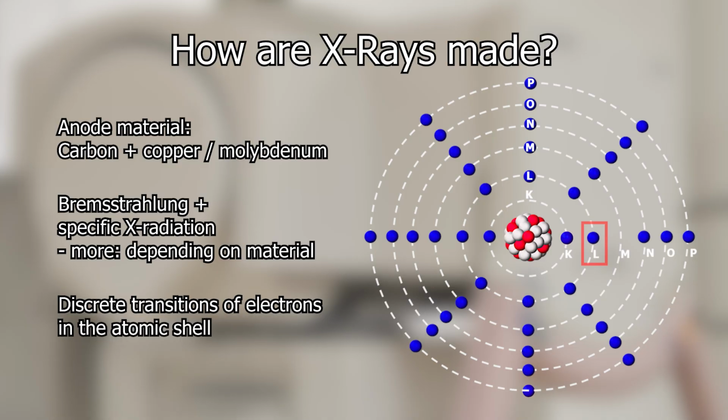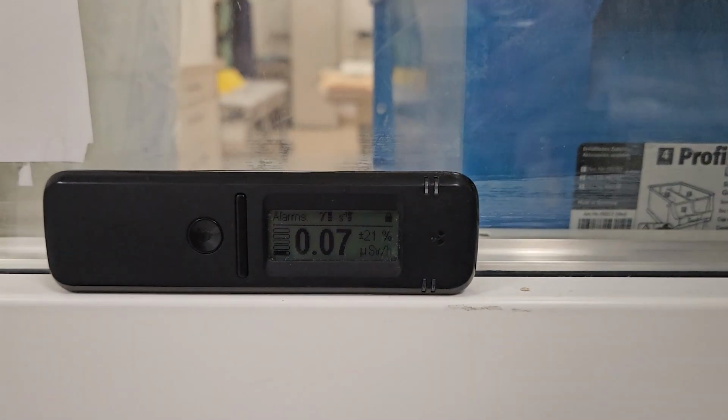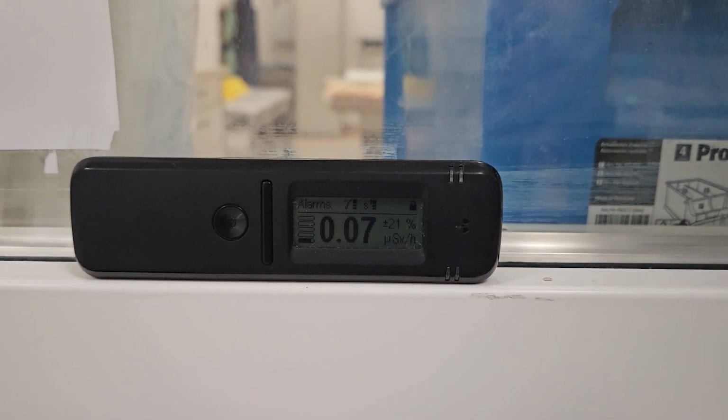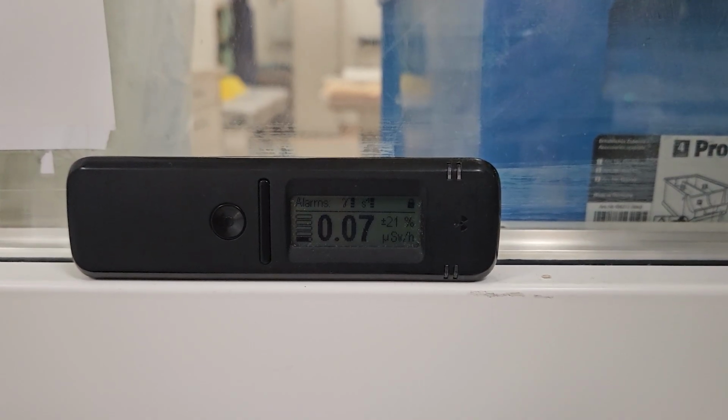We can use this device now with the basics in mind, but at some point we should add another theory part when it comes to the finer points of the operation. Right now we are imaging. However, we can only measure the natural background radiation as the glass contains lead. This is radiation protection glass. It does not contain so much heavy metal that it's colored like in the nuclear laboratories, but it still provides protection.